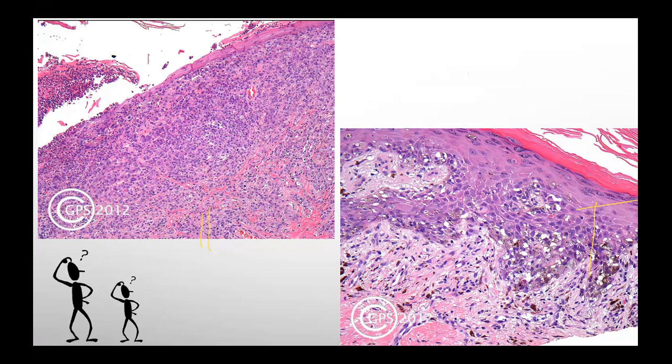Usually it is, as Dr. Amin said, a bit unusual with a nodular melanoma that is symmetrical, dome-shaped and a polypoid tumor as well. And the dermal component has smaller nests with an expansile growth. And usually the tumors are epithelioid. Okay, as we see here.